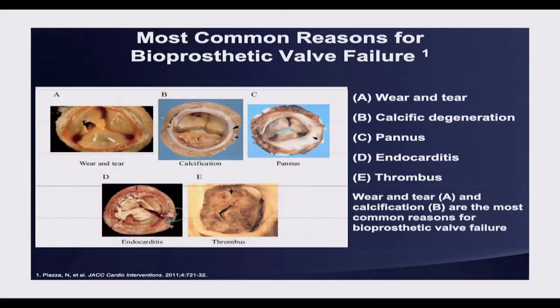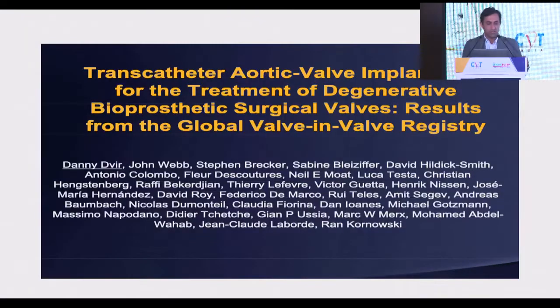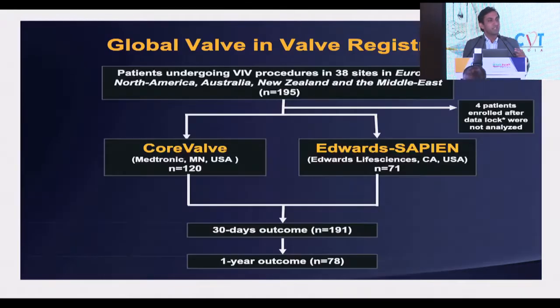And why valve in valve? We all understand because all these bioprosthetic valves fail and a redo surgery carries a very high risk of complications. These are the mechanisms, the way a bioprosthetic valve fails. There could be wear and tear, calcification, pannus formation, endocarditis, or thrombus formation. I just wanted to share some data from the valve in valve registry, because this will help us to understand how we plan our valve-in-valve cases.